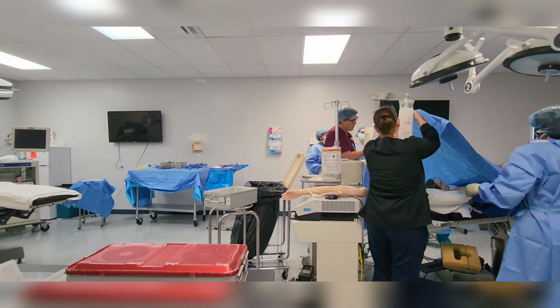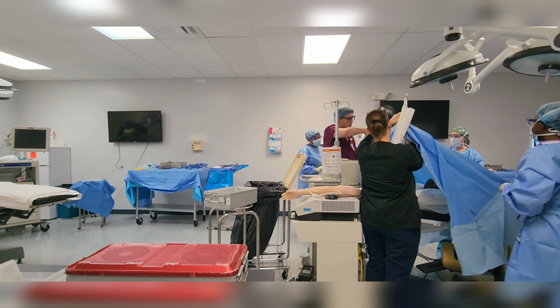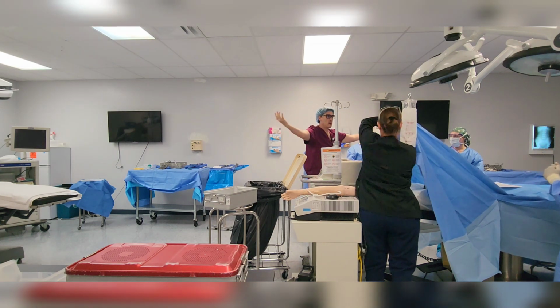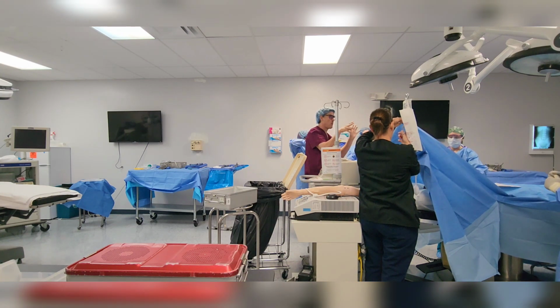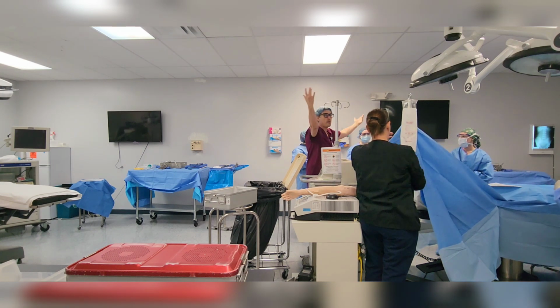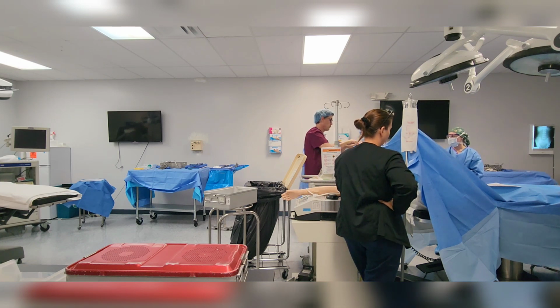So this is the point. Yeah, I'll go over that a little bit later. There is an extension, like I said, sometimes when you're in supine, your arms are out, and the arms are in. There's a part on this kind of drape that you extend outwards when the arms are extended, and that helps. Because believe it or not, if you don't do that, they'll have the fingers hanging out, and doctors freak out when they start seeing fingers. Like, they just throw a blue towel over it.